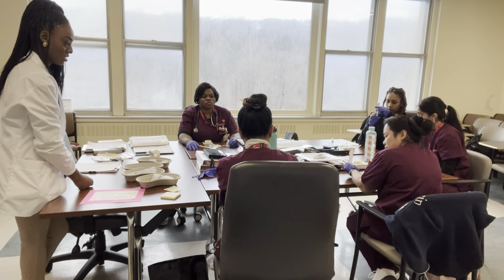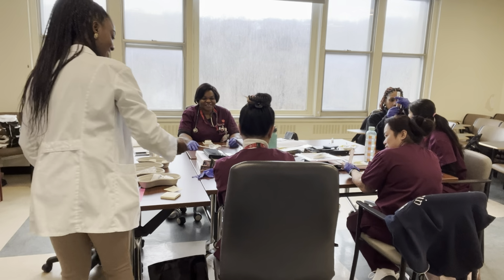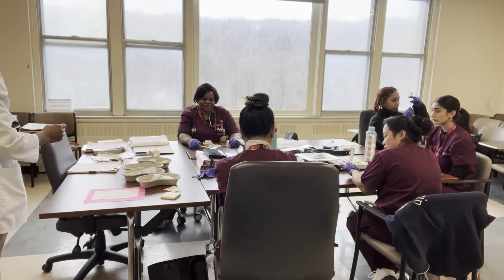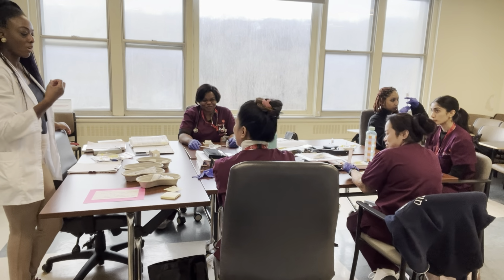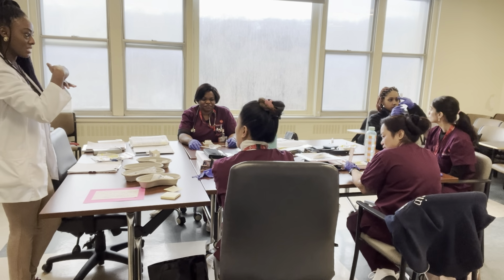Okay. Good. You hold it. You inject with your thumb. Oh, you see that? You're shaking. You should have held it with these two fingers and then injected. Okay, so take some deep breaths, because you're shaking. No, it's normal for me. Okay. But you're letting go of the syringe. Don't let go of the syringe when you're administering, because you don't want to cut the person's skin in any way.